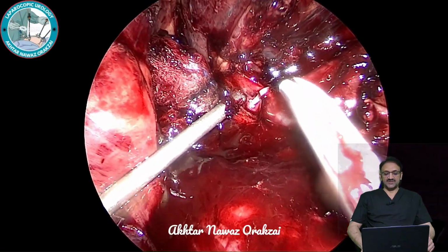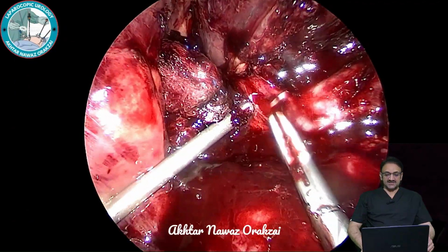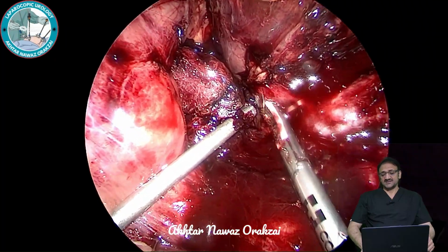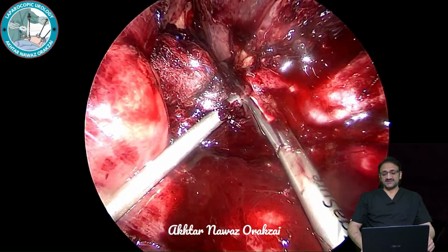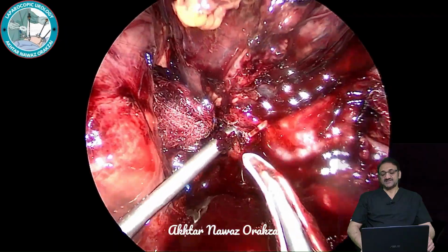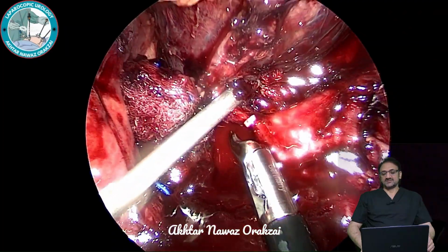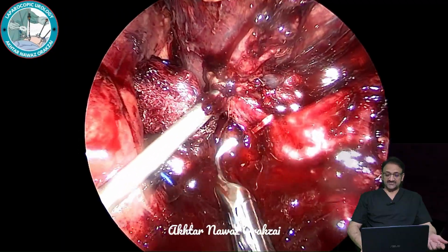So now we are trying to apply another clip. A surgical gauze piece here and there, and a surgical helps us reducing the bleeding and cleaning the field around. However, it is a continuous struggle, but we are not converting. We have not yet decided to convert, as everything is safe.